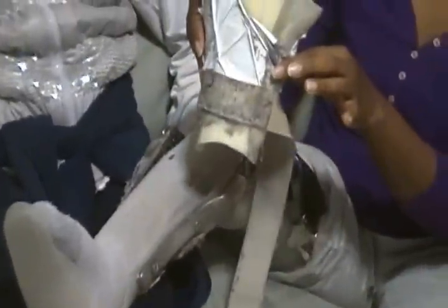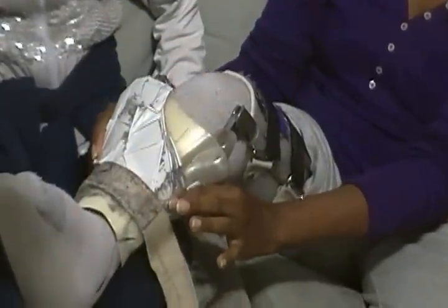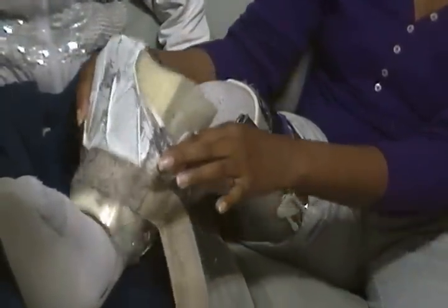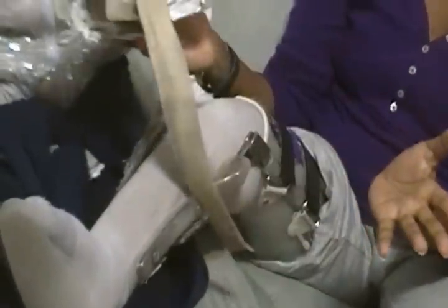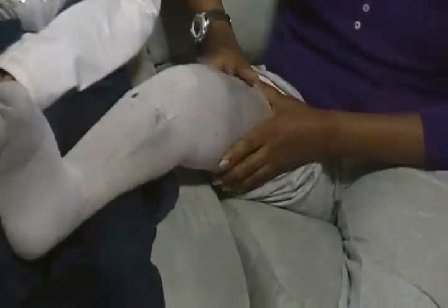You simply take off the strap. The lower half is the important part — the shell that protects the tibia, your weight-bearing bone. Without this strap the brace is no good. Then release the straps on the upper shell.